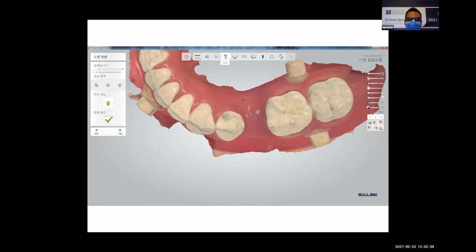the prosthodontist, by consulting with the surgeon, virtually places the implant beneath this prosthesis he designed. And after placing the implant in the virtual space, the surgical guide is produced. The surgical guide has some sleeves on it that direct and guide the drills during the surgical session, showing how deep it should go, how straight or how angled it must be.